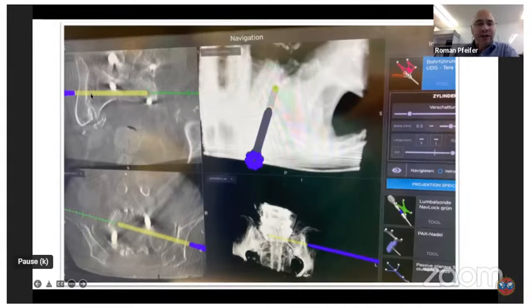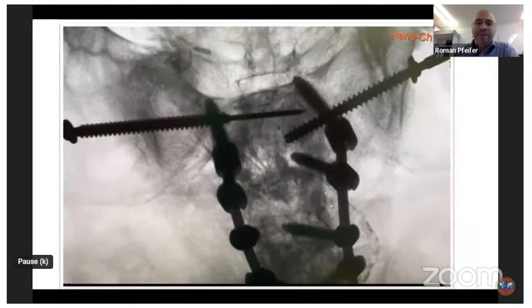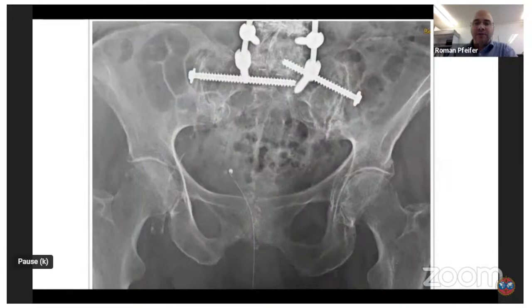We placed a 6.5 millimeter screw, with more or less 100 millimeters of length. That was the right side. On the left side, the screw was positioned a little bit differently. Initially, we usually use the guide wires and then control them with a CT scan. If we're happy with the result, after that we can use the screws to position them in the right way. This is the final result after the surgery, and this is the result after mobilization of the patient, without any complications.